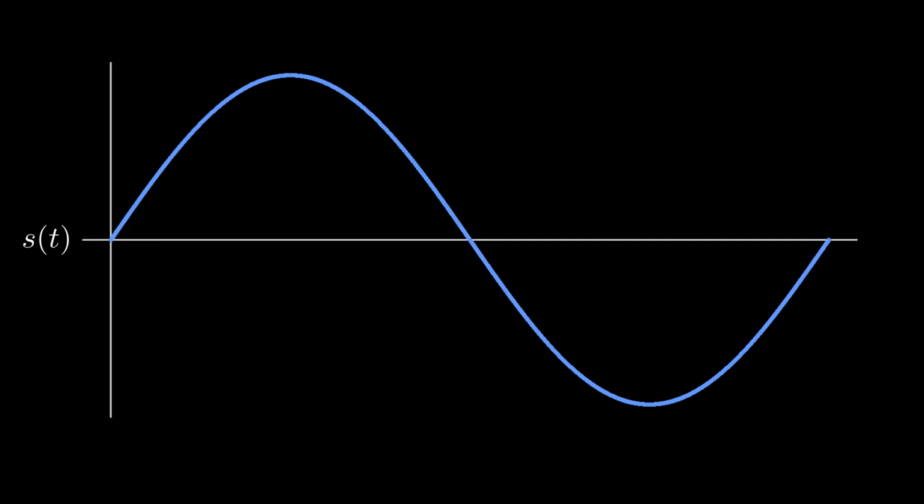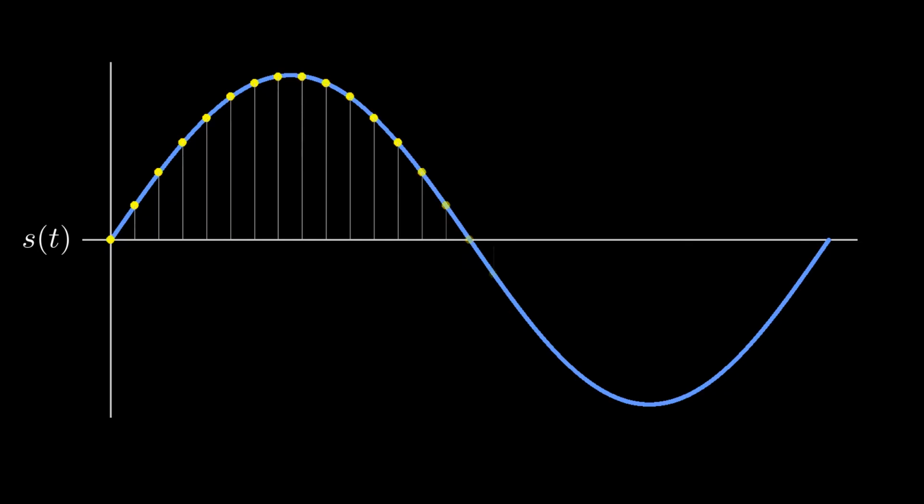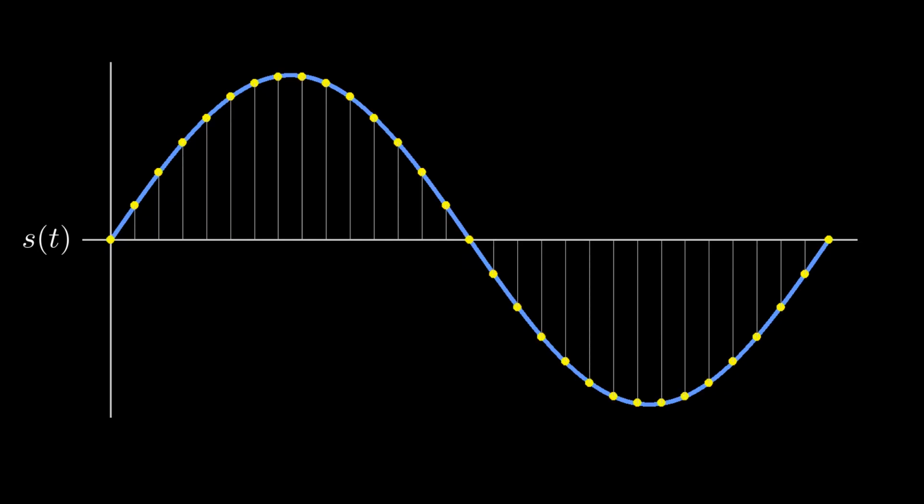Now, NMR and MRI is done with the help of a computer, believe it or not, and if you have ambitions to start analyzing the frequency content of real-life acquired signals from these machines, you'll be moving into the realm of digital signal processing. And there are some intricacies you should be aware of. First, what was a continuous signal has now been digitized. As the signal was delivered to your computer's analog-to-digital converter, or ADC, values were recorded and stored at regular temporal spacings, delta t, where delta t is called the dwell time.